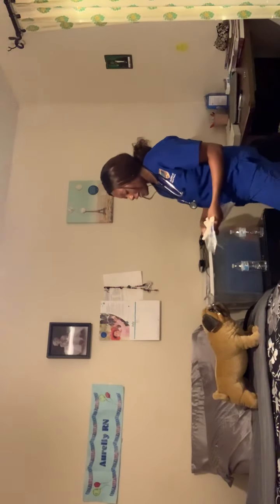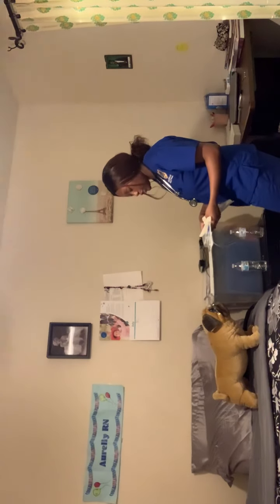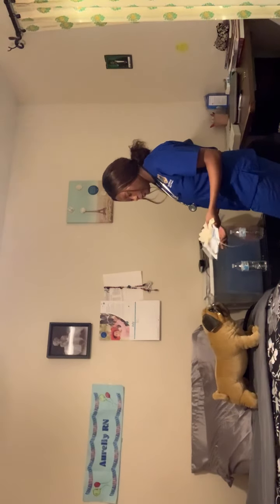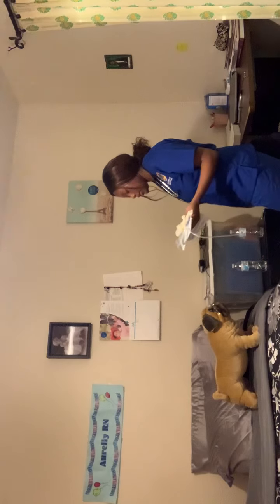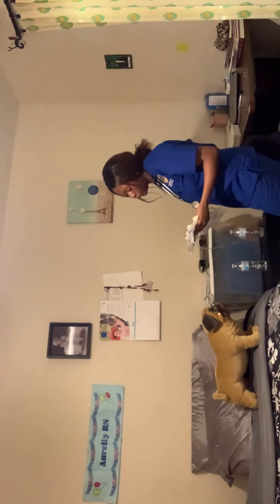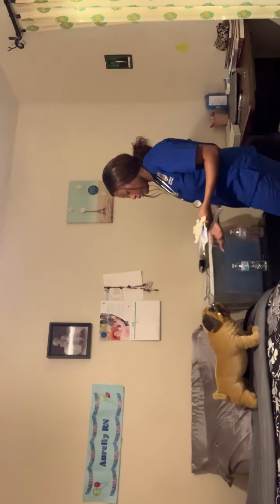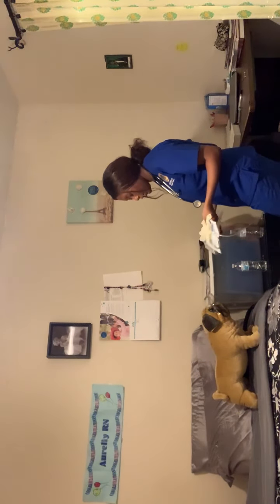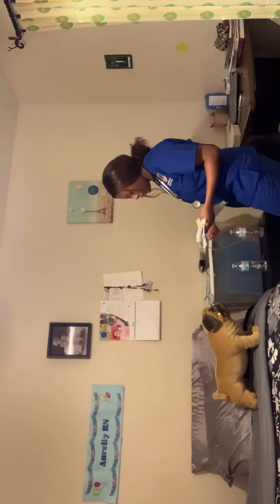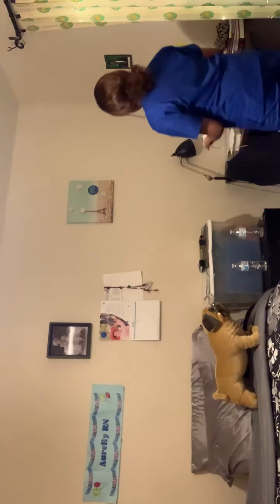Knock, knock. Hi, my name is Ashley and I'm here to be your nurse today. I will be here to insert and remove your NG tube. I have to let you know that you will feel some discomfort in your nasal passage, and maybe, or maybe not, some gagging, but you will be okay. Is now okay enough time to do so? Okay, and do you have any questions for me, ma'am? No? Okay. I place my supplies on a clean surface.